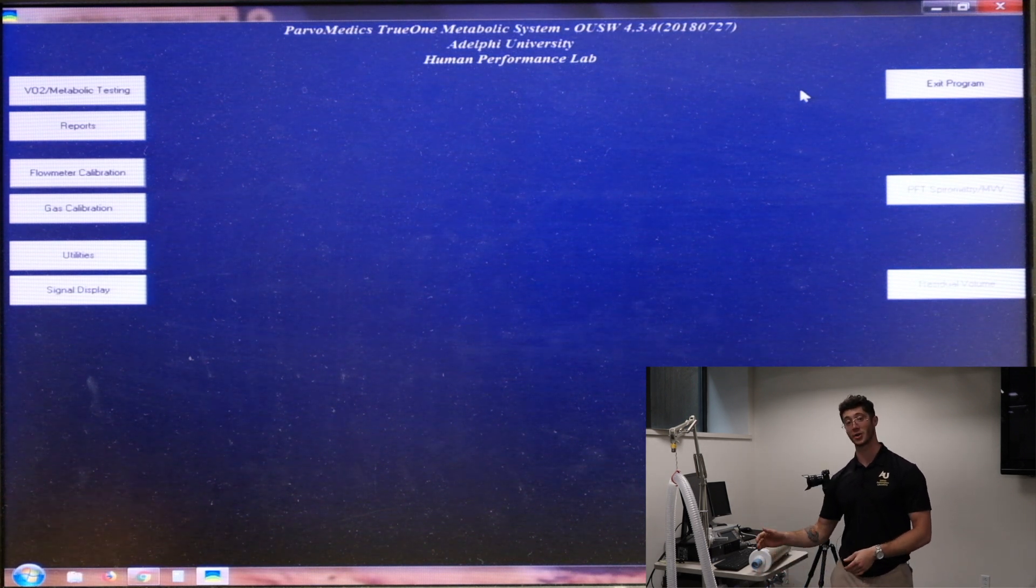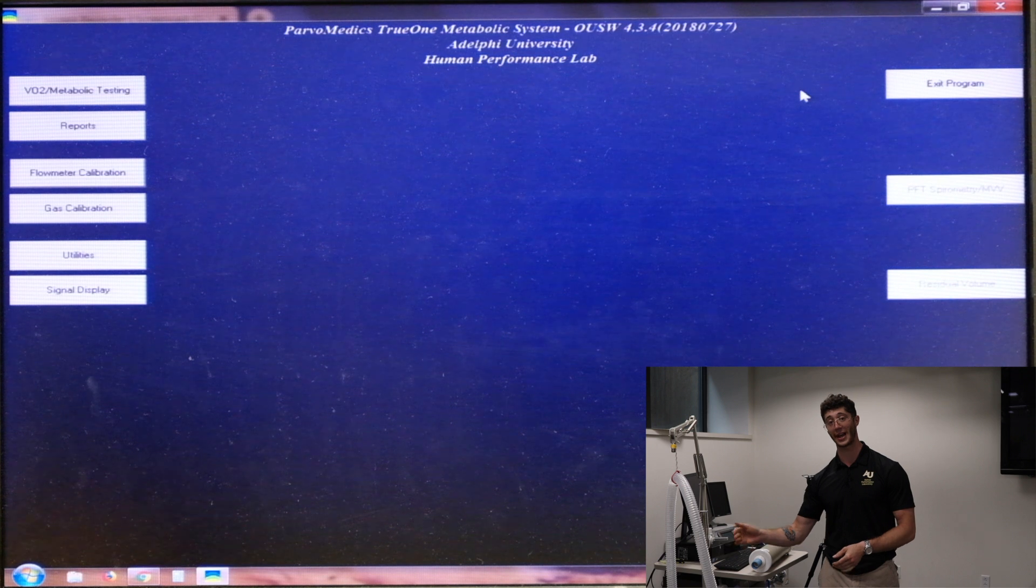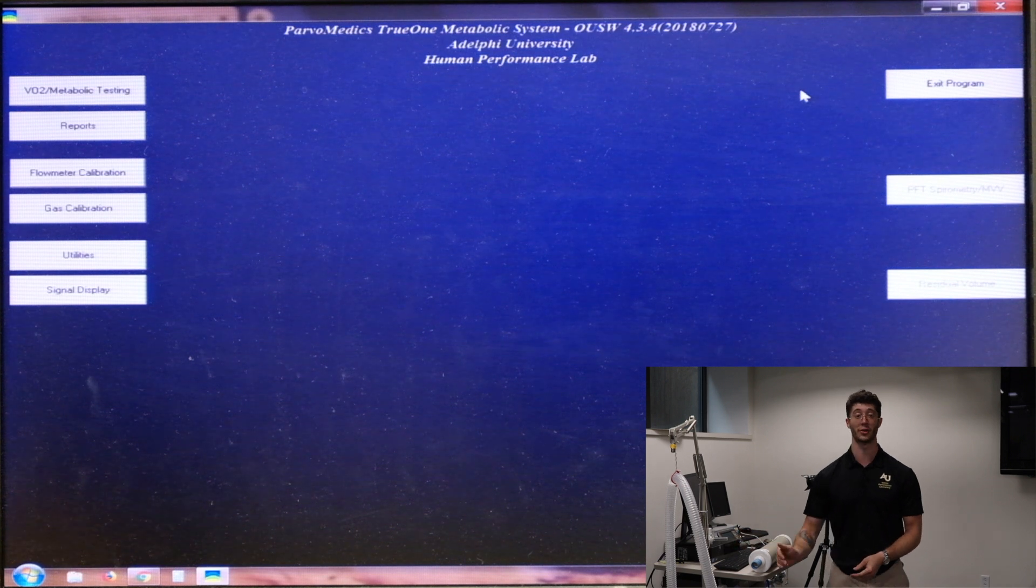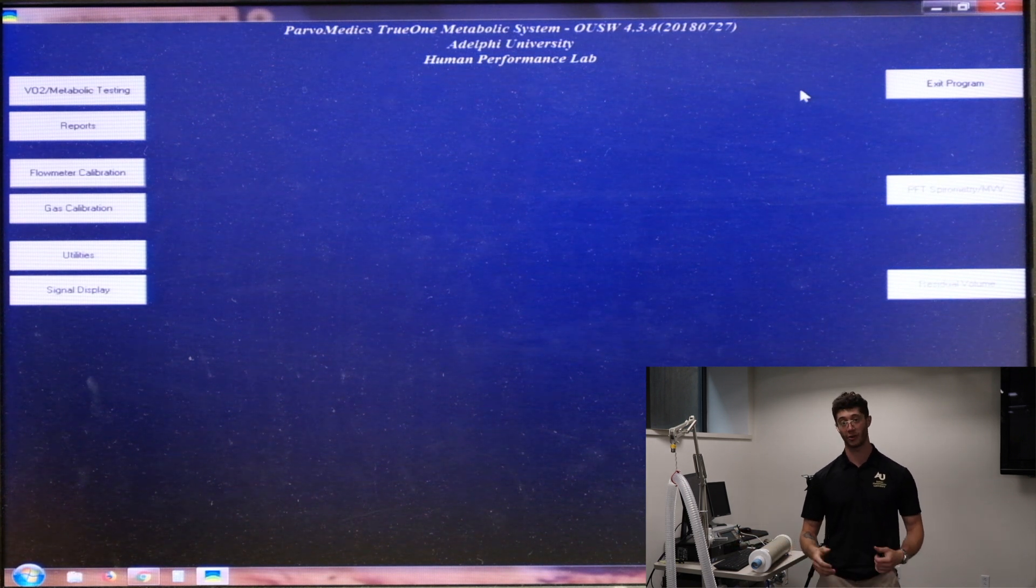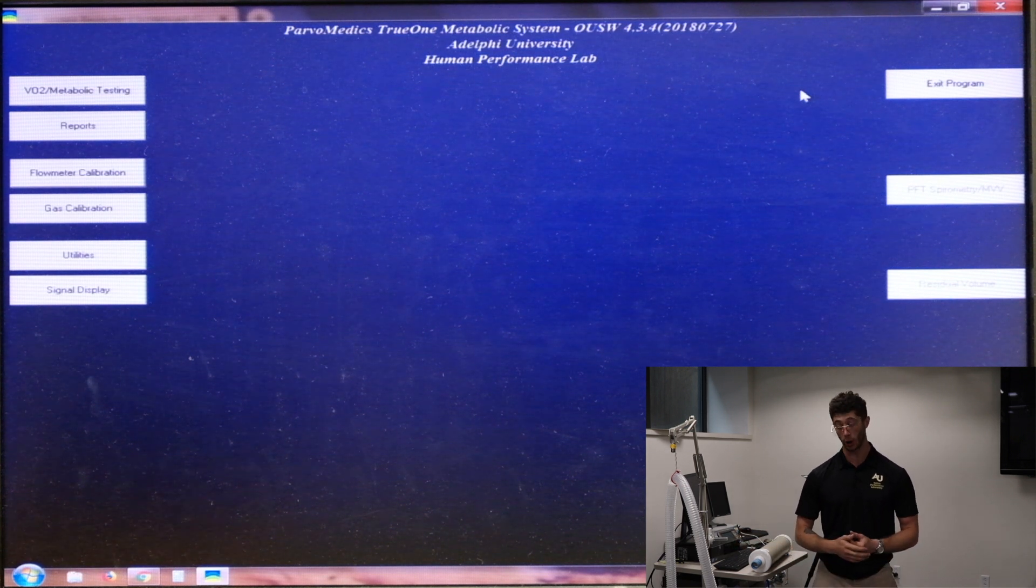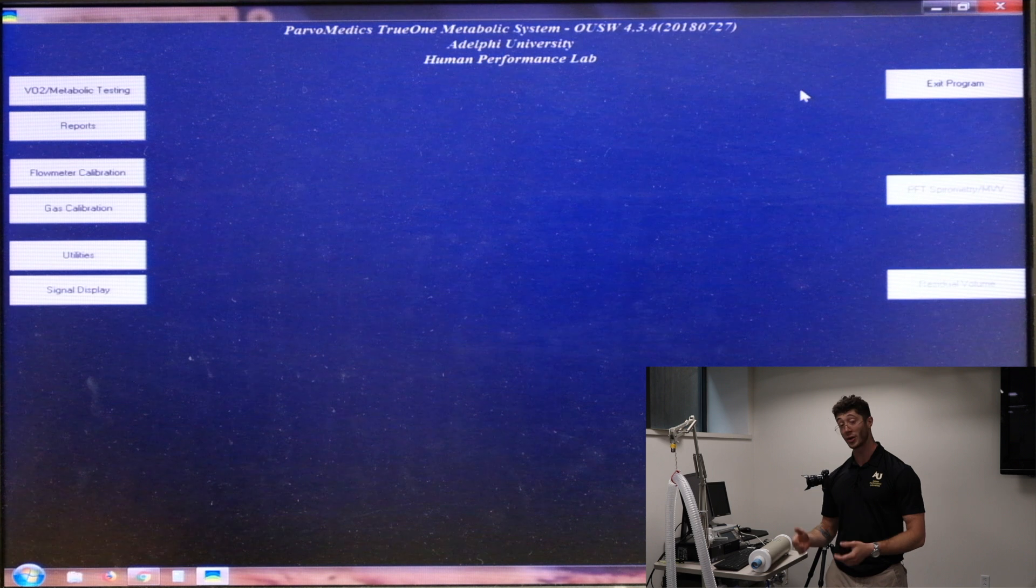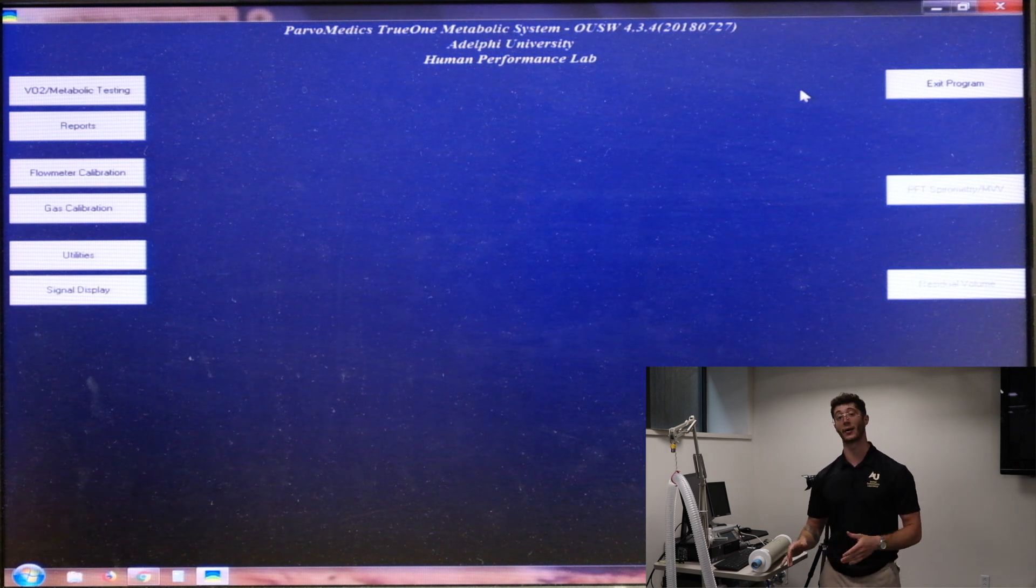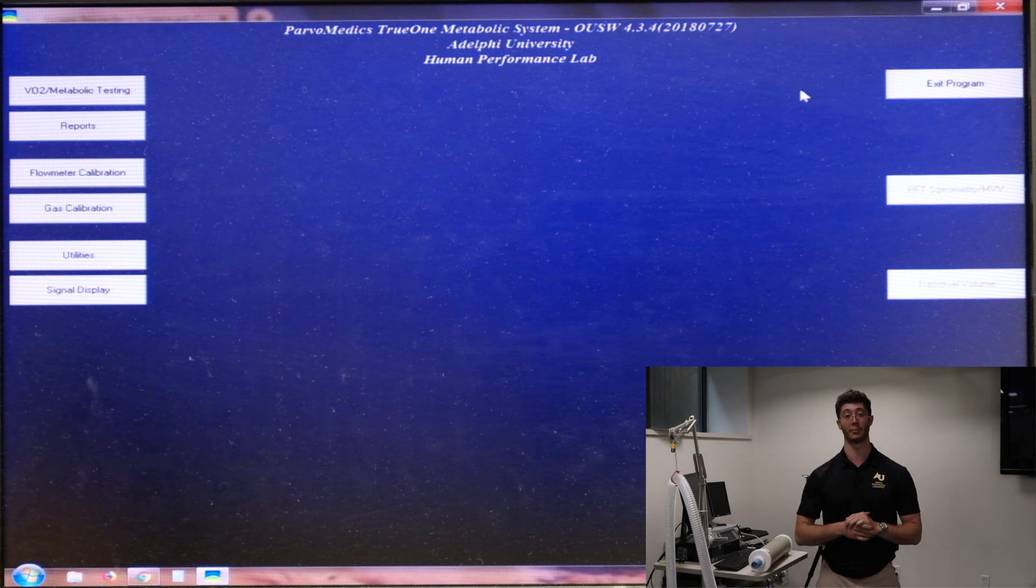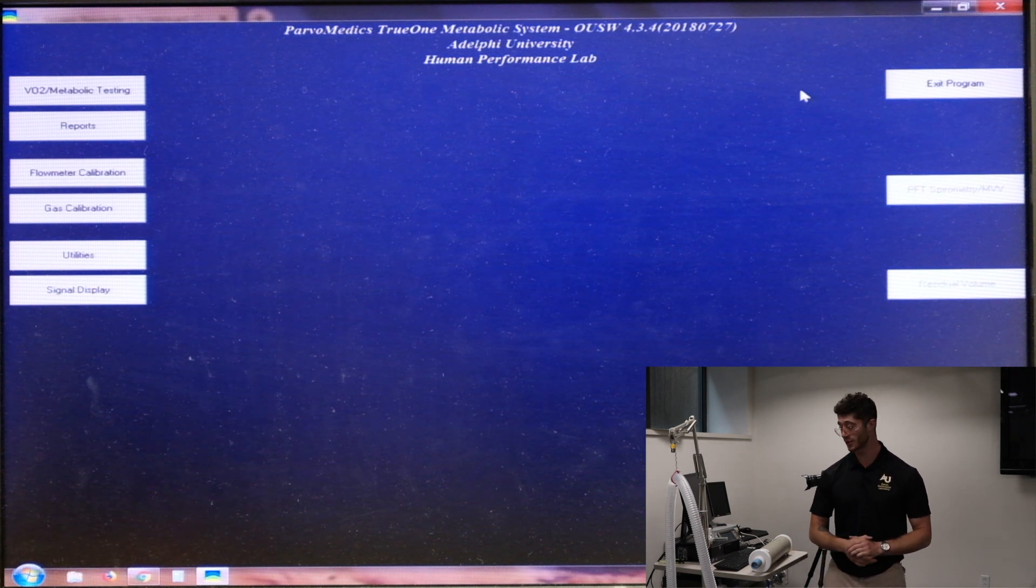So the Metcart switch is on the back, the heater switch is on the front, and then we need to let it warm up for about a half an hour. Once that half an hour has elapsed we can start our calibration process.